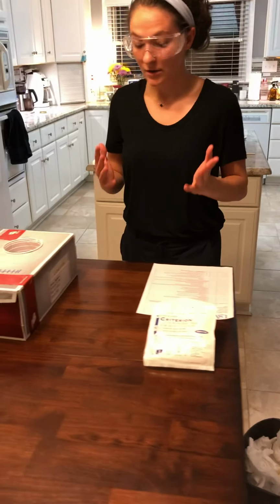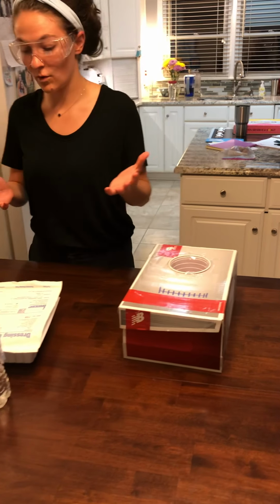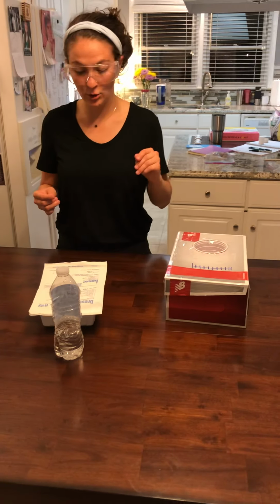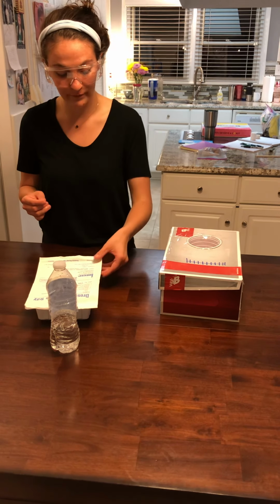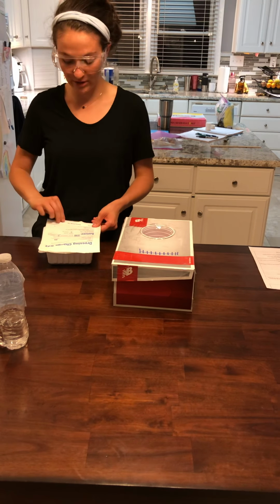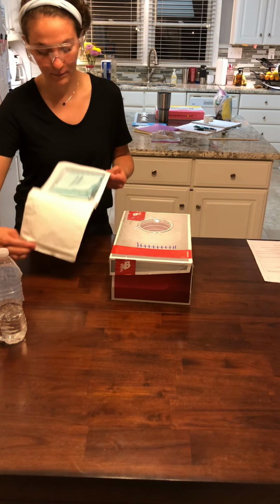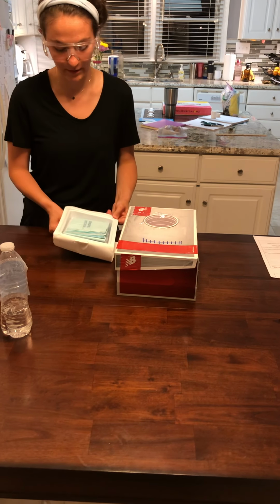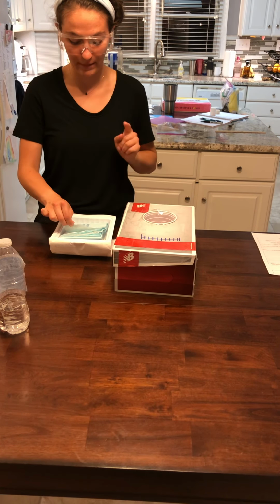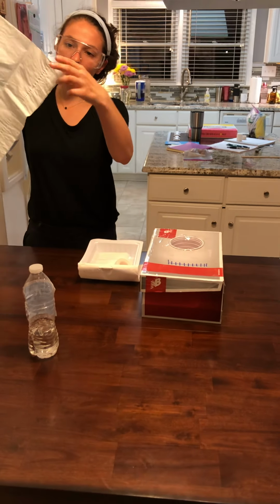Okay, so now I'm gonna go ahead and set up the sterile fields for the rest of cleaning your suture line and replacing your dressing for your wound. So first I'm going to only touch the outside 1-inch border of my tray and pull this back and push it under here. And now I'm going to pull up my sterile field, also only touching the 1-inch border.